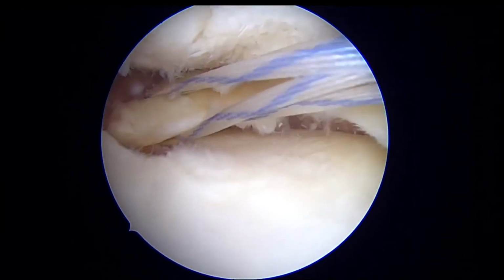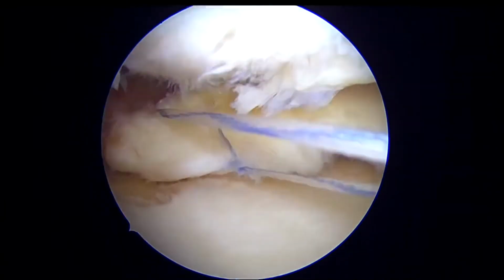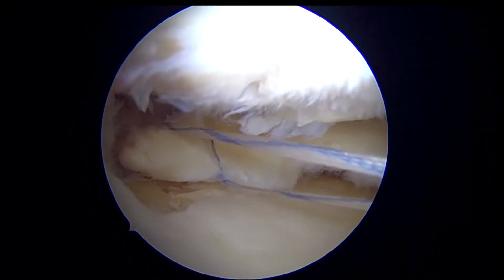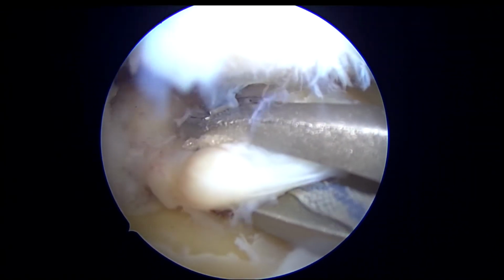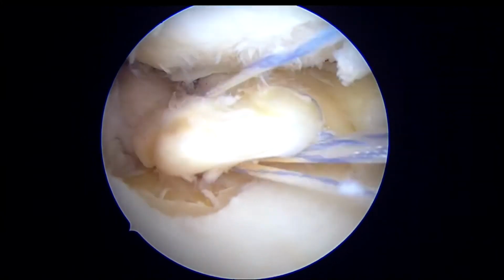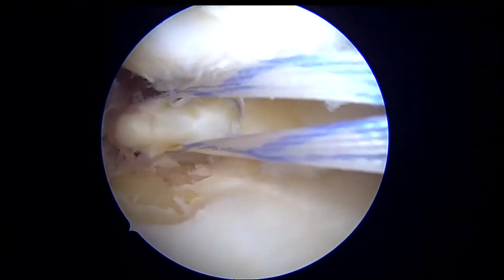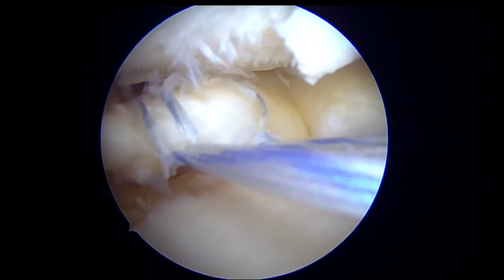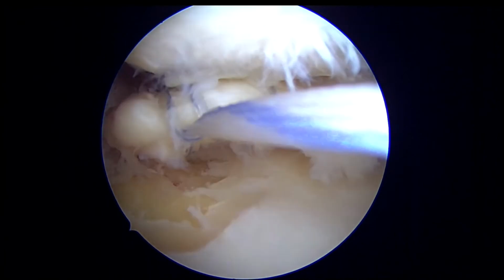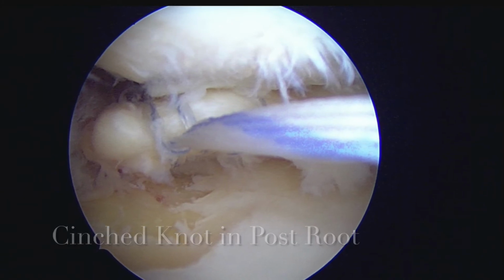So we're going with the first knot, which would be a cinch knot, and a simple along with it. And then we'll go for our second one, which would be a simple cinch knot. So we pull on the meniscus to see it is taut and the bites are through and it is not getting cut through. So this is how the cinch knot looks like.